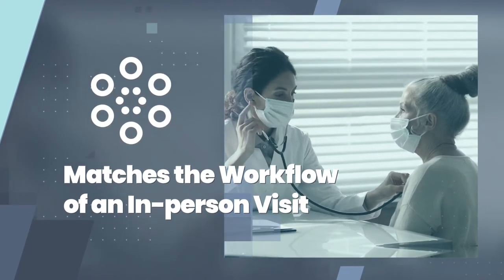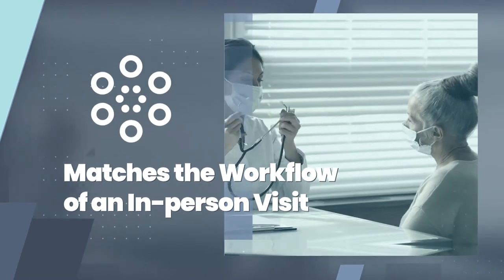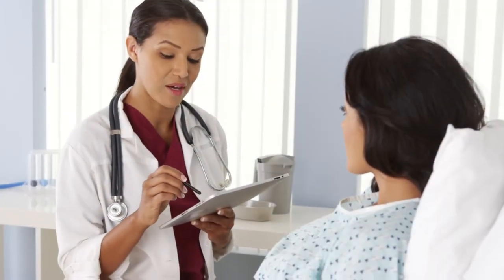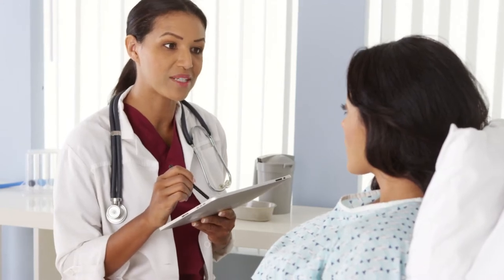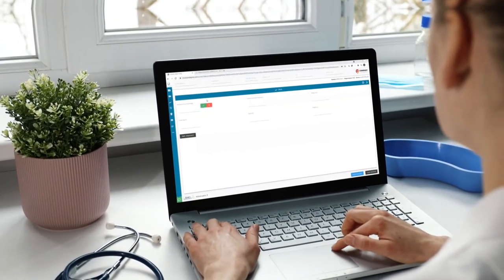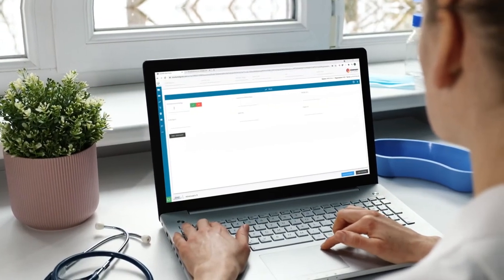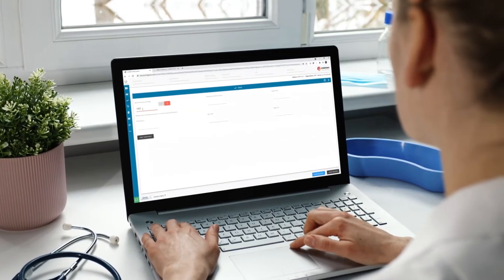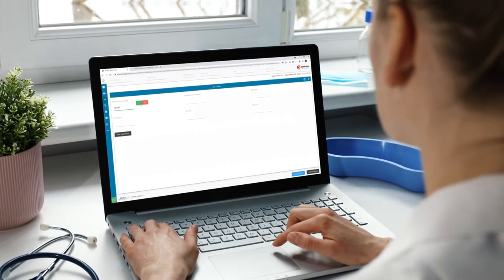Let's walk through the experience so you can see for yourself how it works. An on-site clinician works up a patient by capturing their vitals and preparing intake materials for the remote provider to review before the consult. This information is shared through Agnes Connect so the remote provider has full visibility into the patient.